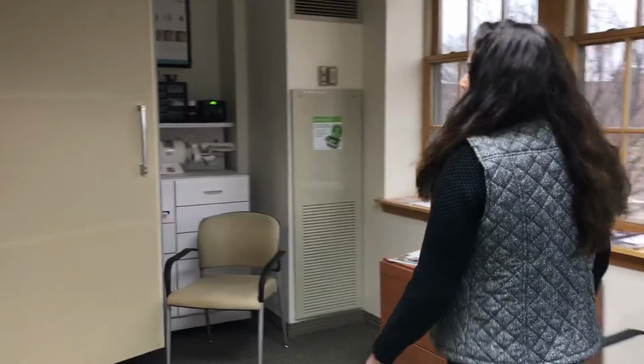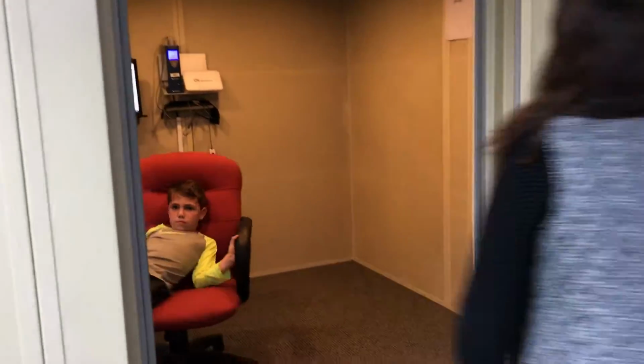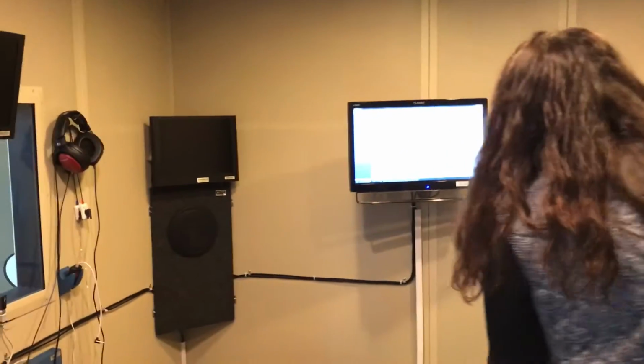And then if you go in here, we'll see the test booth. During testing, we'll close the door so that it's a quiet room for testing. I guess we'll leave it open for us. Sit up tall.